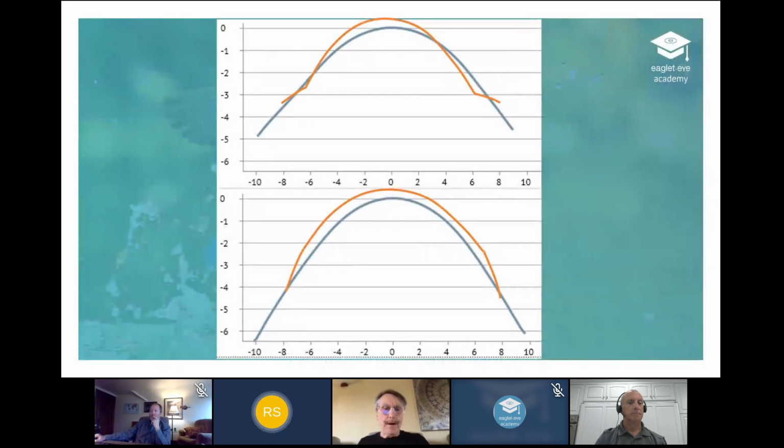When you have the standard Zen lens design, you can order a lot of APS, so a lot of toricities, but only in the edge of the lens. So the optical zone, the limbal clearance, the smart curve, they all stay spherical. But what Brian already told is that all the eye was very toric.